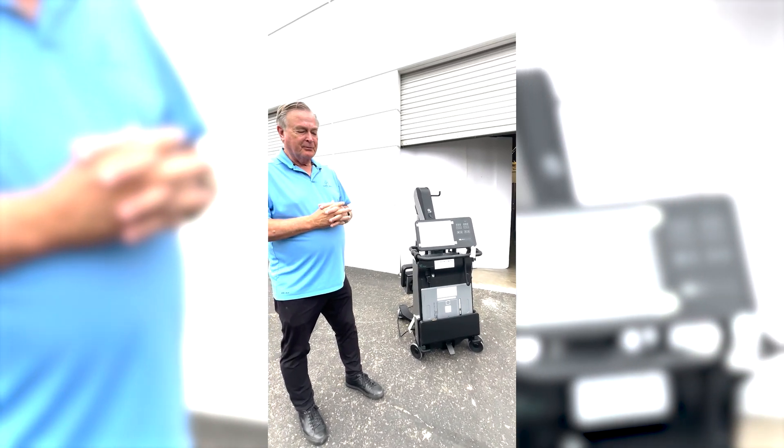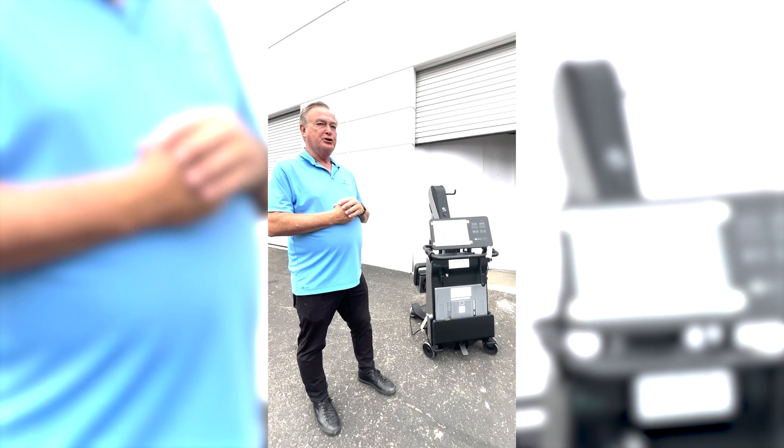Hi, I'm Mike with Maven Imaging. Today we're going to review the Fuji portable, called the Fuji Acro.